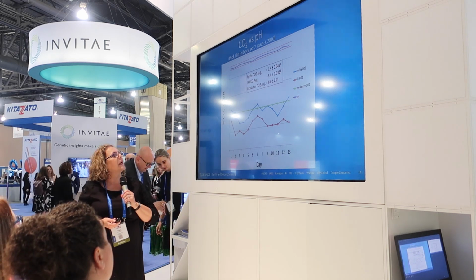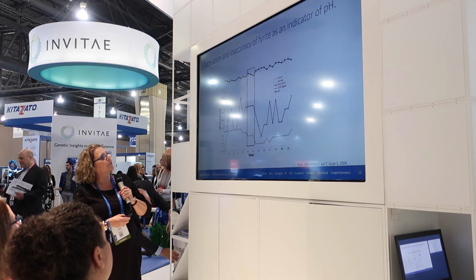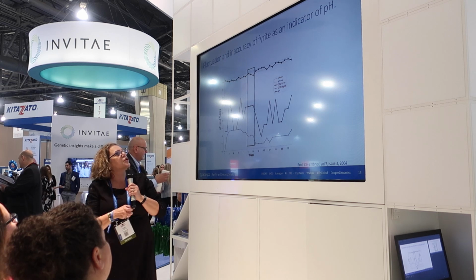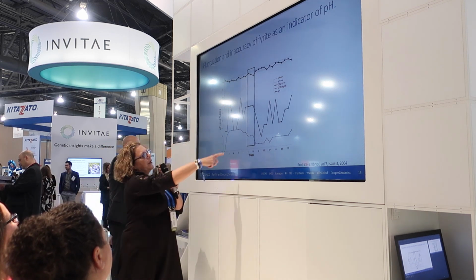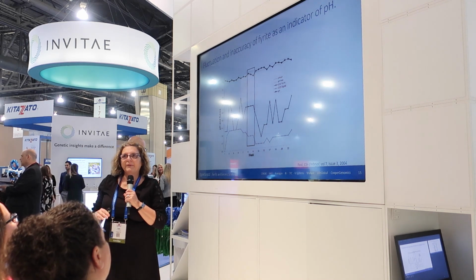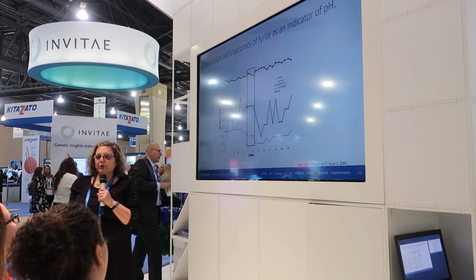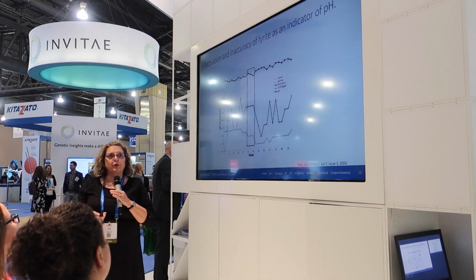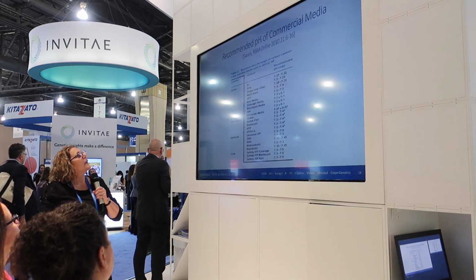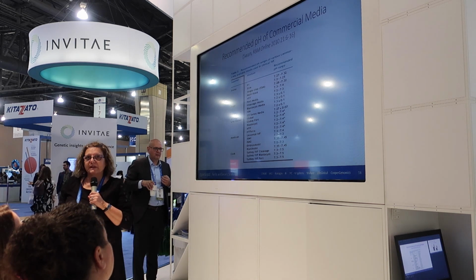you're measuring at. And this is just another slide from Dr. Poole. You can see that even though there has been a fluctuation in pH right here, the Fyrite did not pick it up. It didn't pick up that there was an actual change in CO2. So it's very important to know the type of tools you're going to use to check your pH.